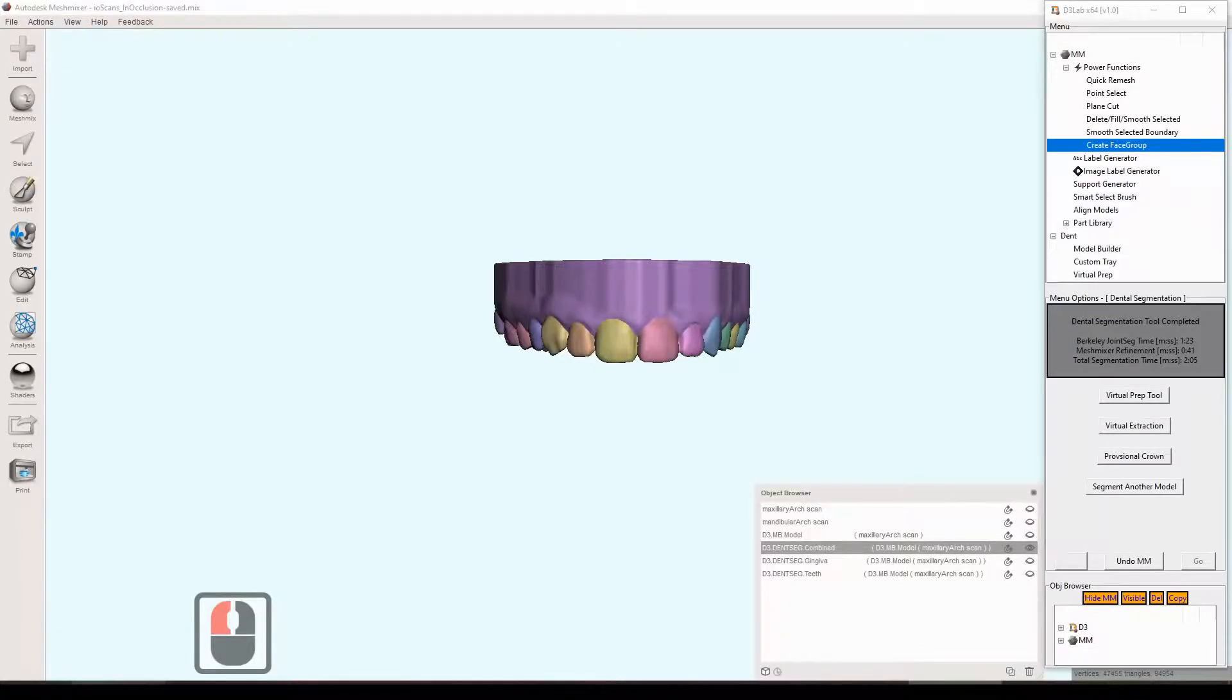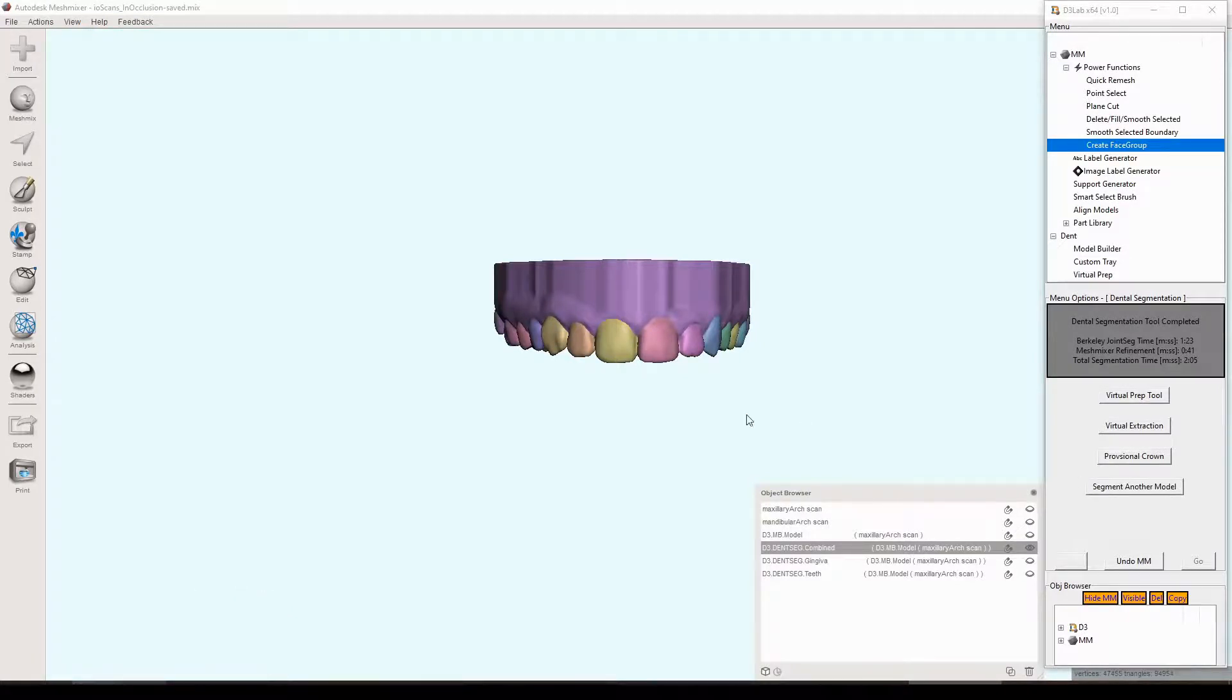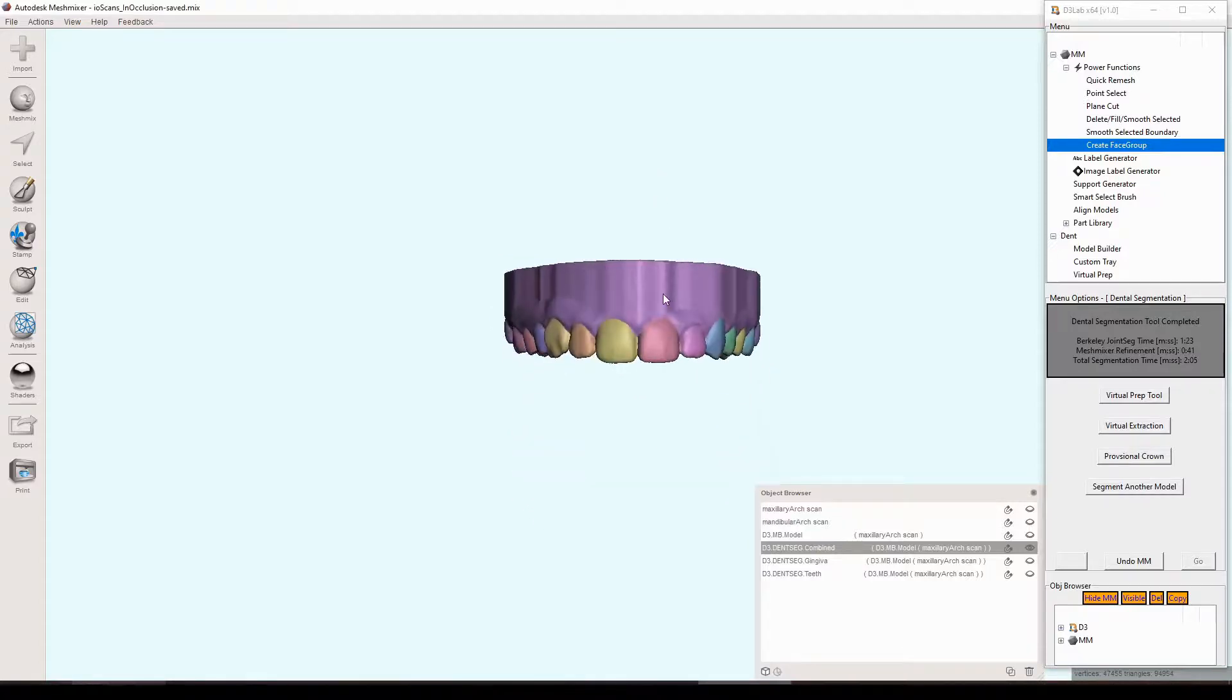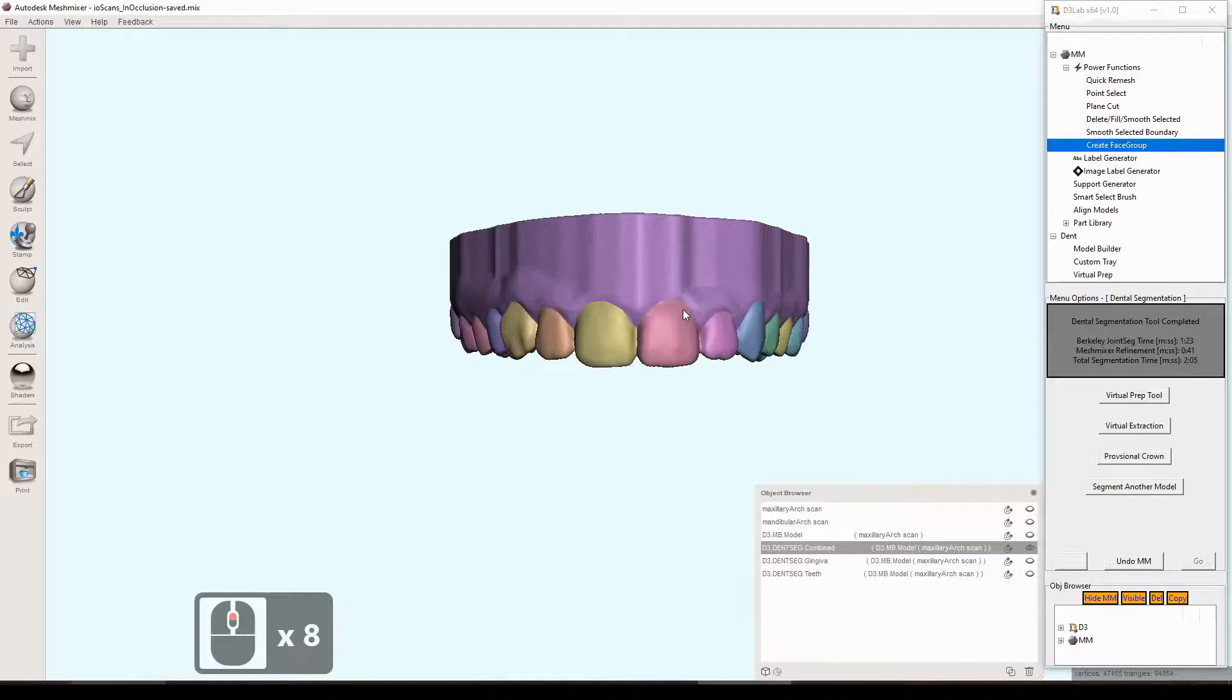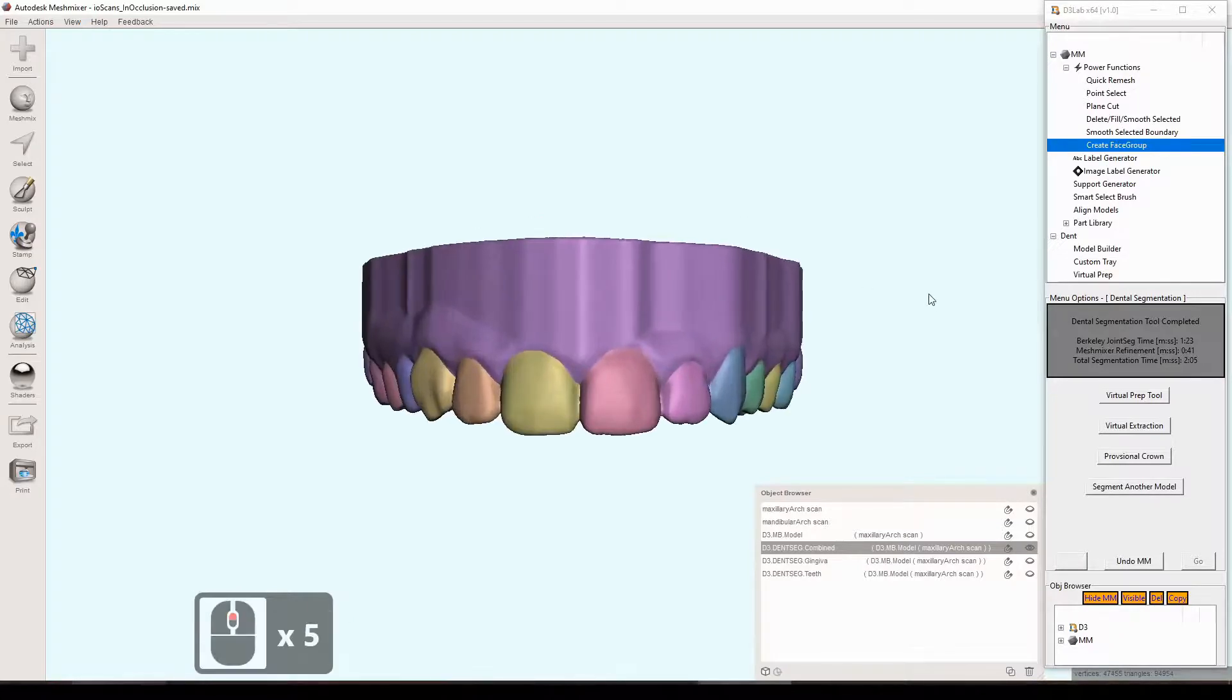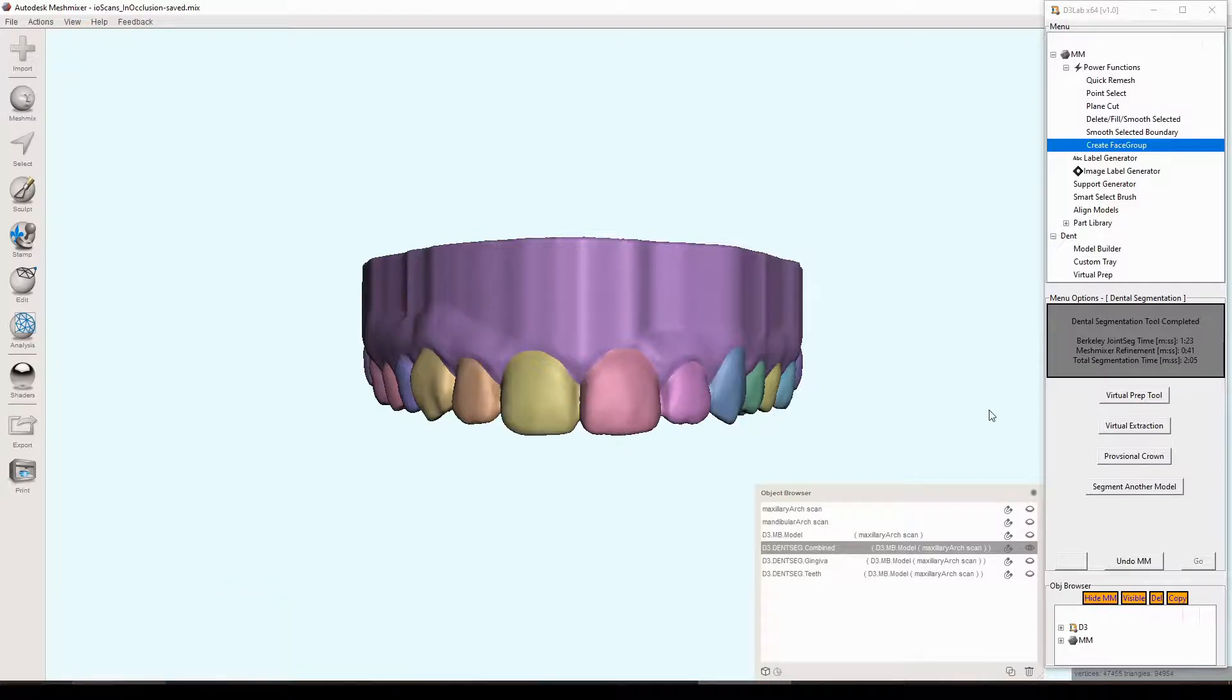Okay, so we'll start by just reviewing our model from the prior segmentation tool. Each tooth is individually segmented, it's got its own face group and the only other face group on the model would be the gingiva and the rest of the model base.